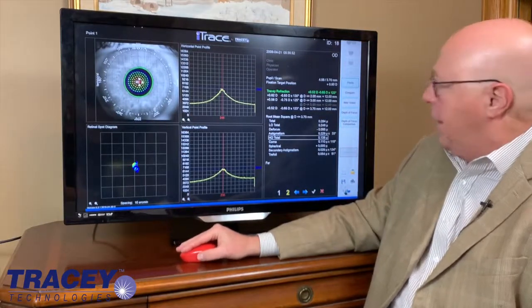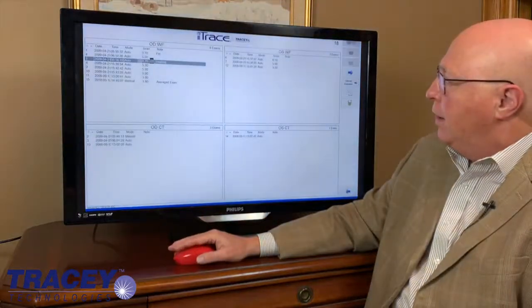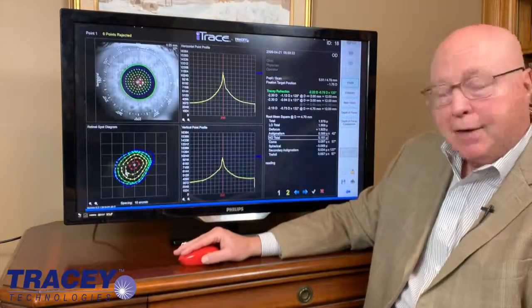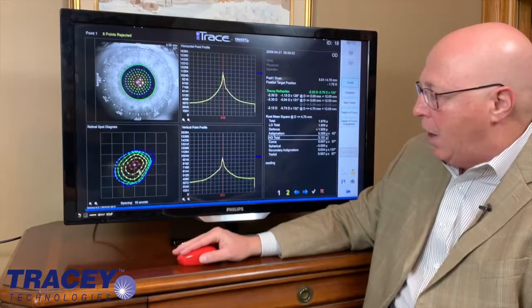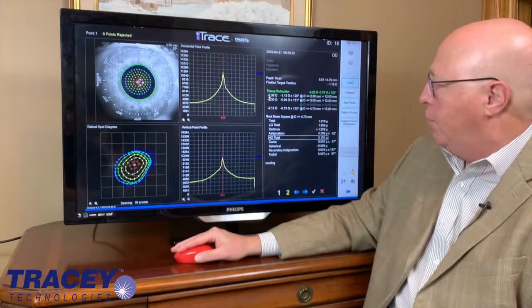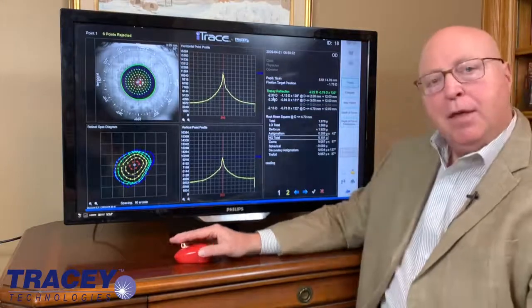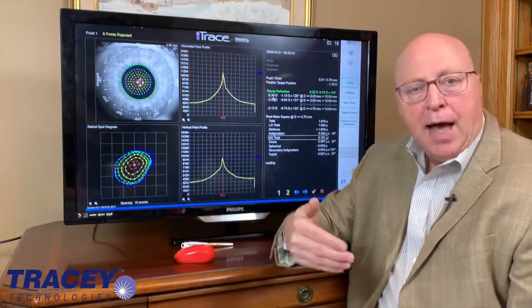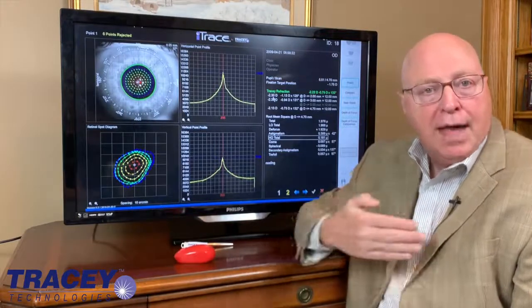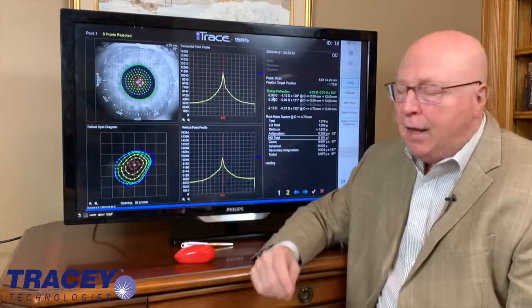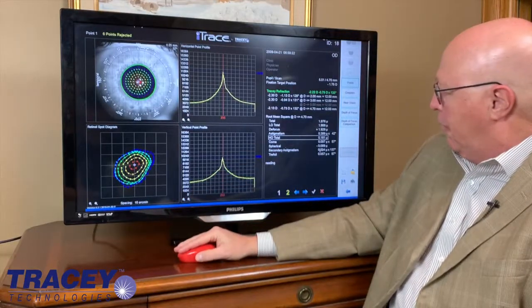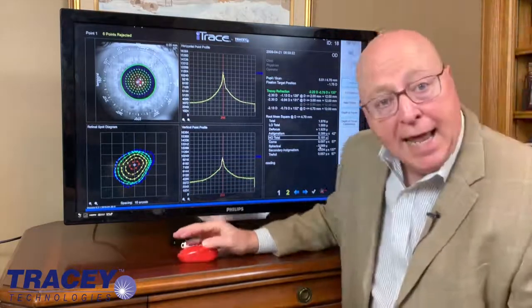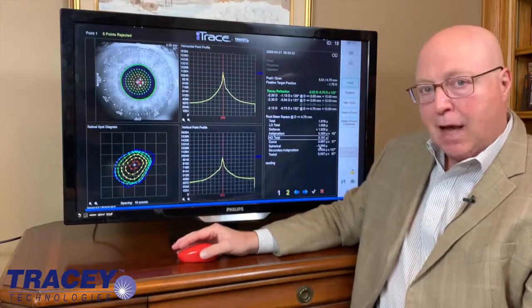When you compare that to his reading exam, it's a very different pattern. These lasers go in now and land with about a two to two-and-a-half diopter minus. So typically what happens in accommodation is you have a sphere shift — the eye is capable of creating extra minus: two and a half, three and a half, four diopters. It's really incredible in the young eye what the patient can do to have this zoom lens. In this case they now have spherical aberration on the minus side. When you have negative spherical aberration, it's indicative that the patient is accommodating.